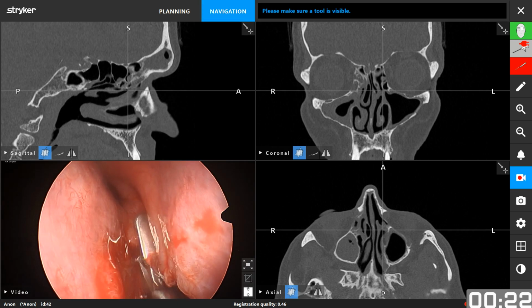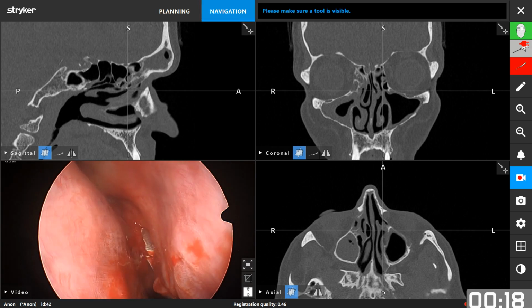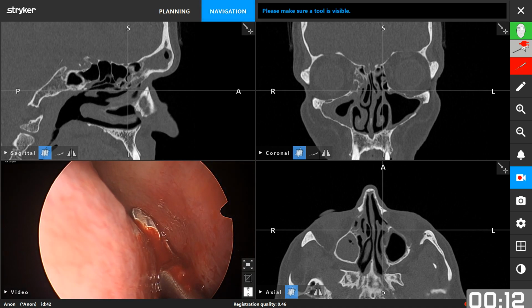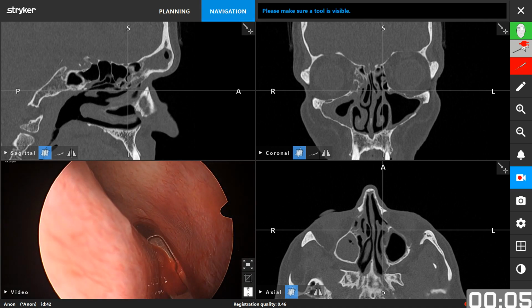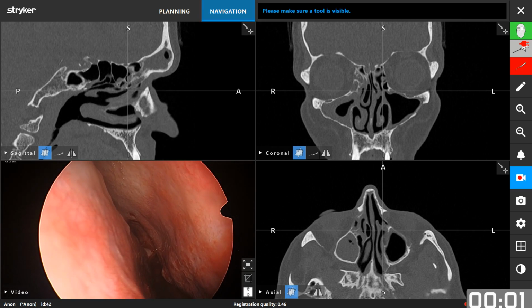Back bites, one and two bites, so that can help us to easily access the infundibulum and removal of the uncinate process. Yeah. So reflect it again, and then through-cuts or the microdebrider. Anyway, both of them could be used.